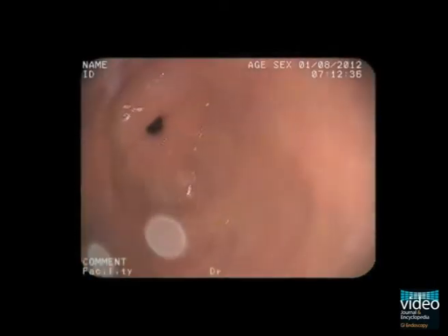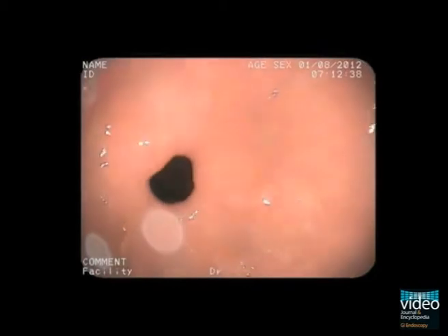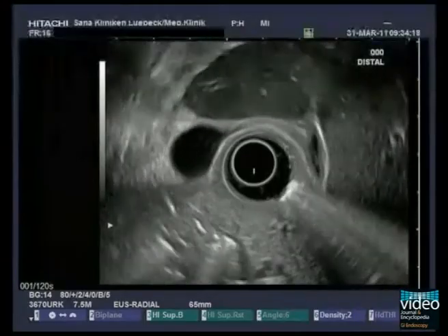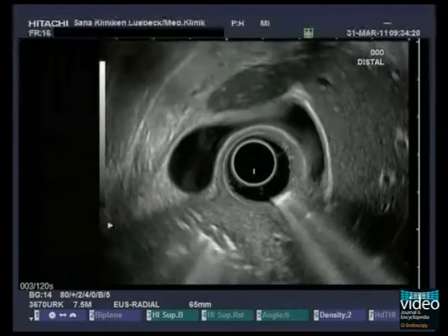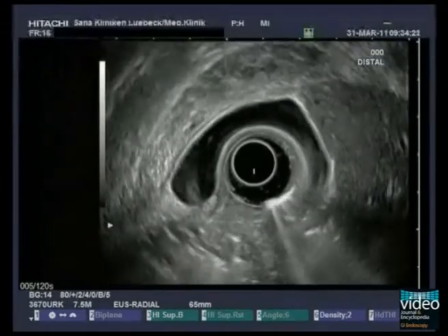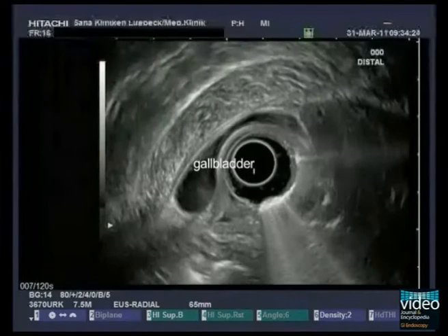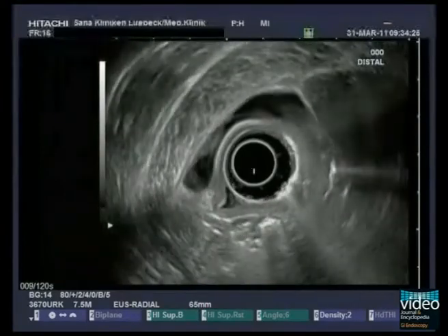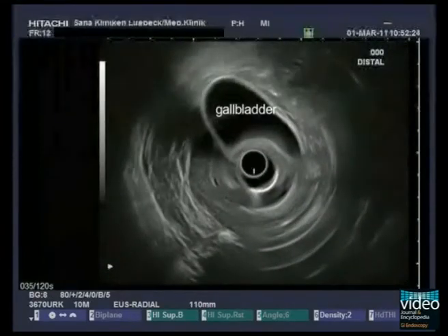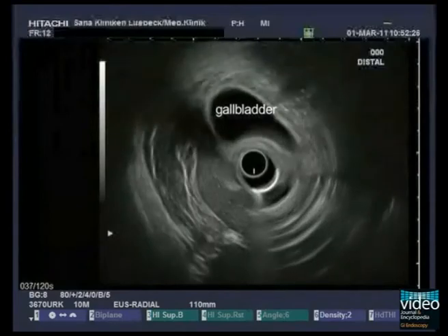For the passage through the pylorus into the duodenum, optical orientation is necessary. If you fill the balloon with water, sliding back into the antrum is prevented. From the duodenal bulb, parts of the portal hilum and the gallbladder can be seen. The gallbladder can be examined by push and pull maneuvers.